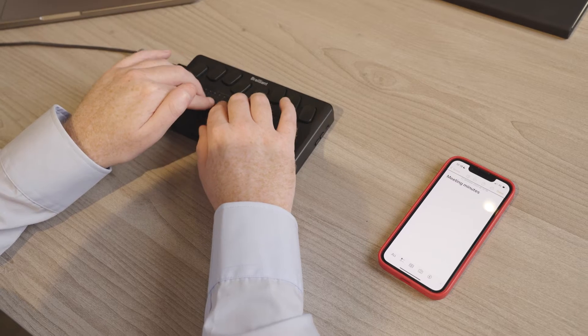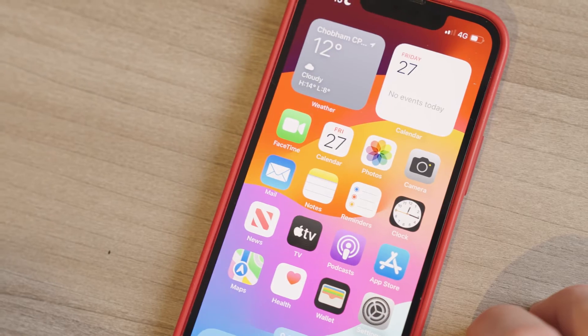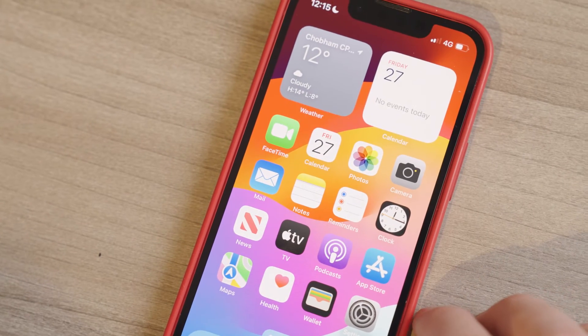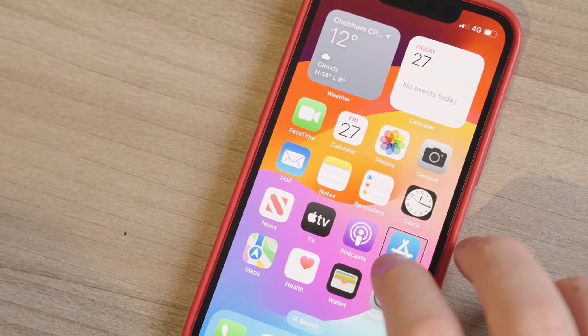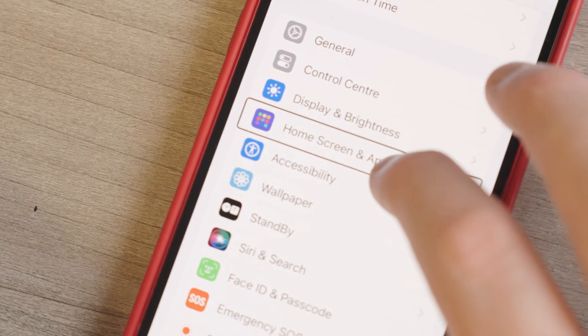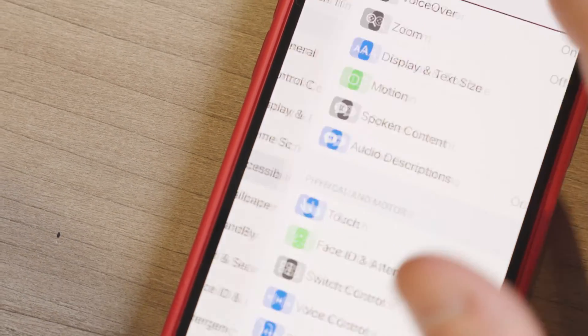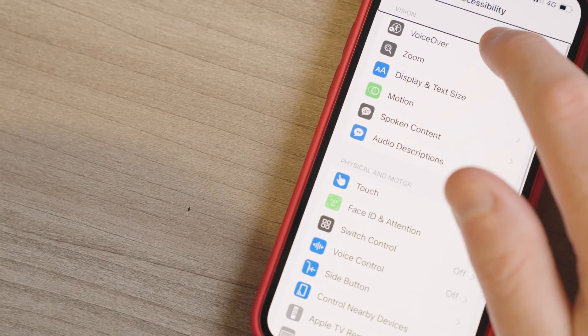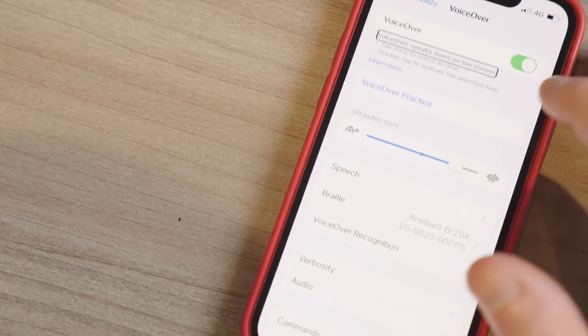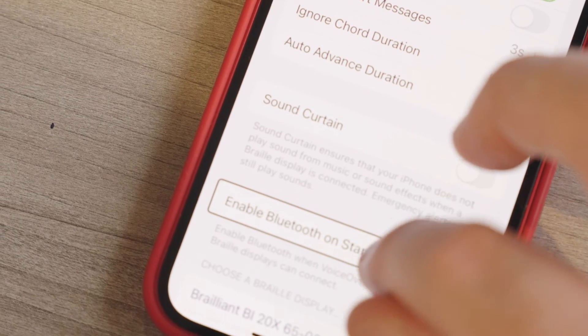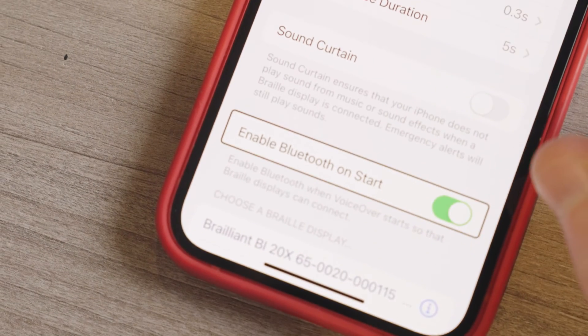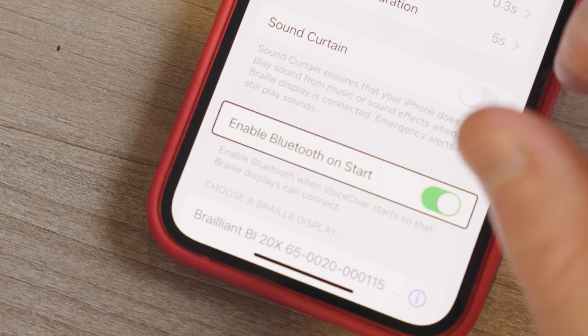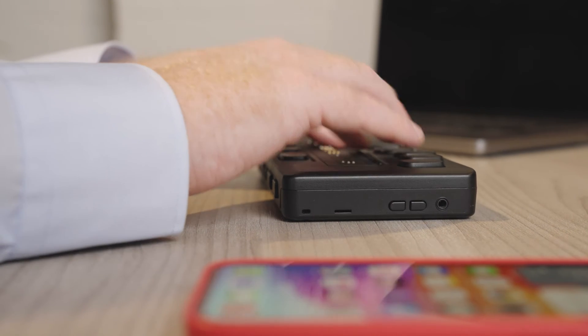The man navigates through his device settings to toggle Bluetooth on startup. Open your device's settings, scroll down and select Accessibility. Navigate to VoiceOver, tap on Braille, and activate the Enable Bluetooth on Start option. By enabling this option, Bluetooth will automatically turn on every time you start VoiceOver.